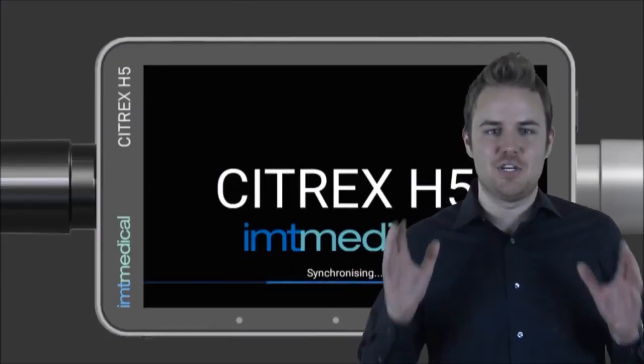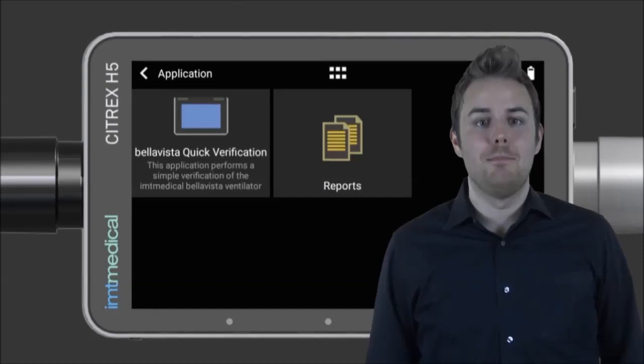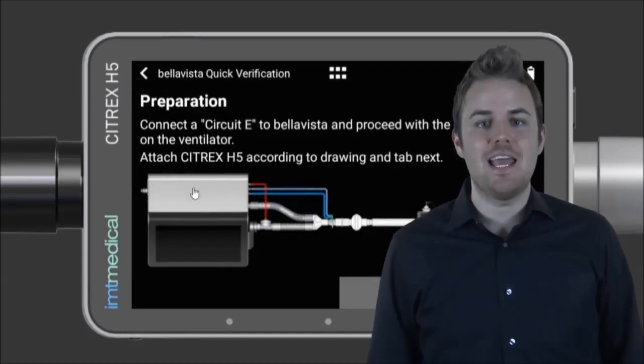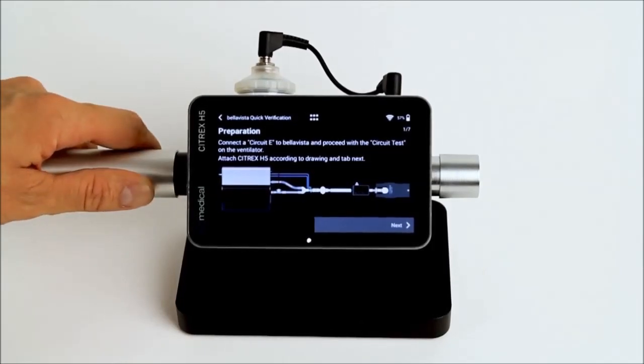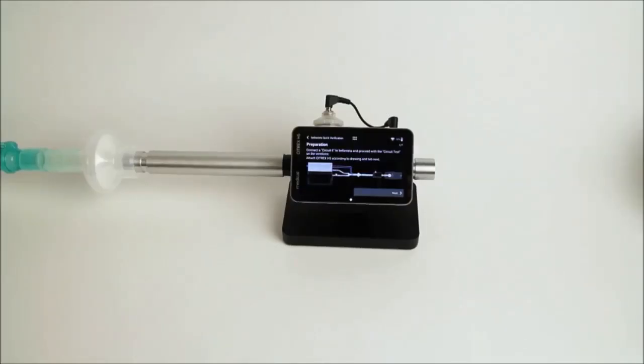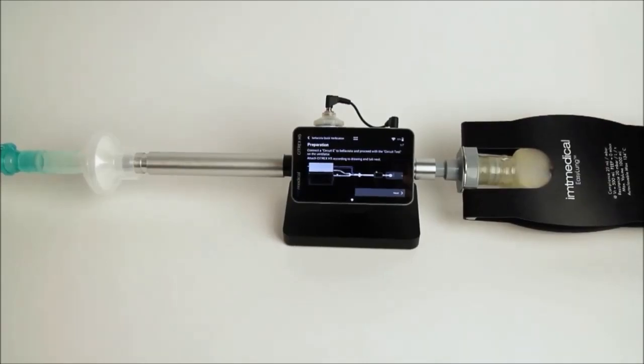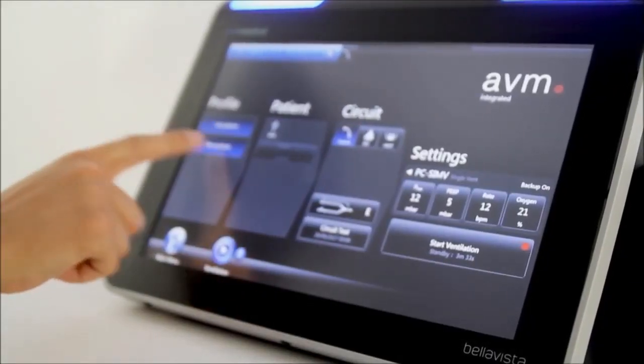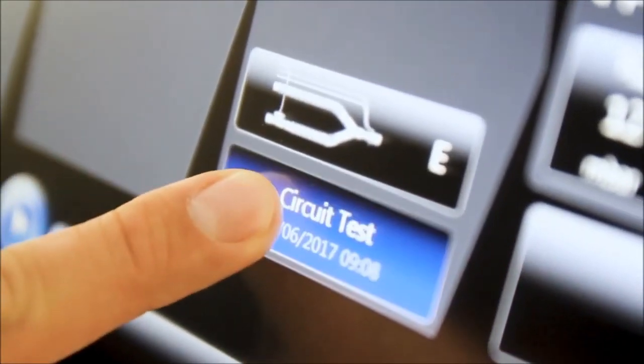So let's get started. Launch the app, BellaVista Quick Verification on CITREX H5. Then connect a BellaVista ventilator to the CITREX H5 gas flow analyzer according to the diagram. Ensure that a successful patient circuit test has been performed before.